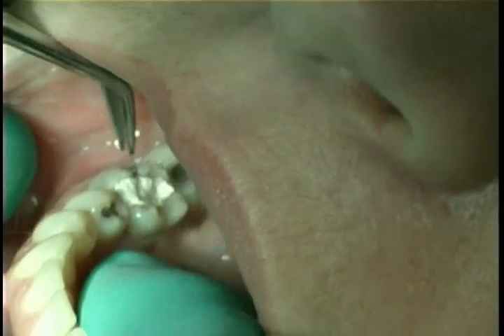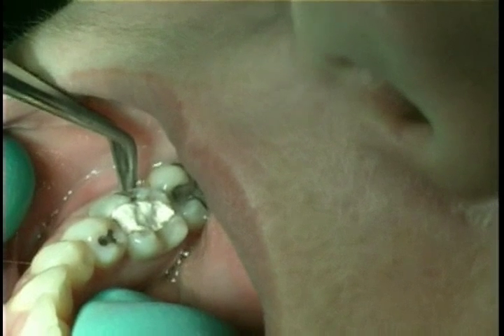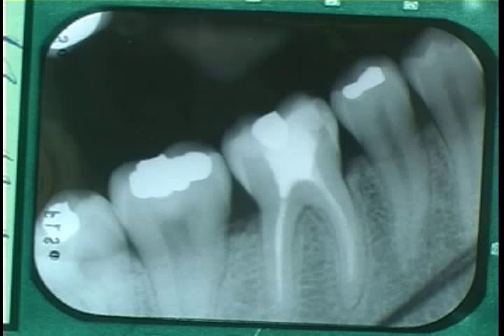Tooth number 30 was endodontically treated and a perforation was made to the furcation. It was decided to extract the tooth.